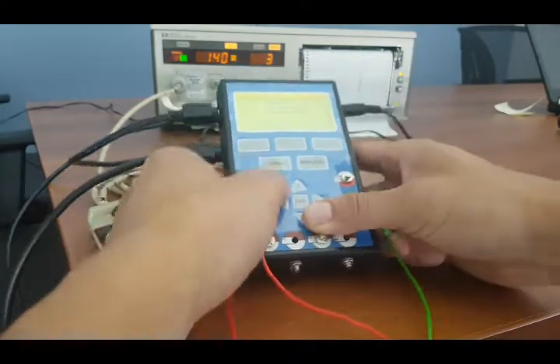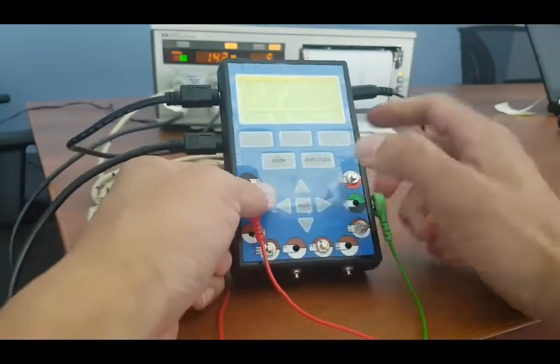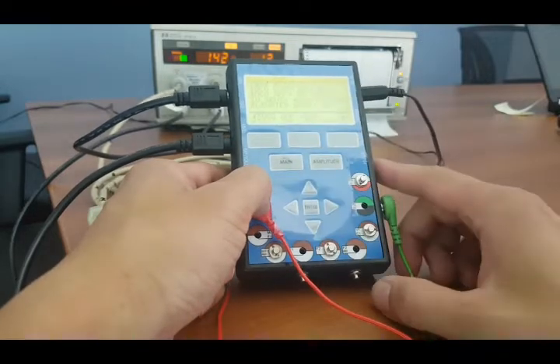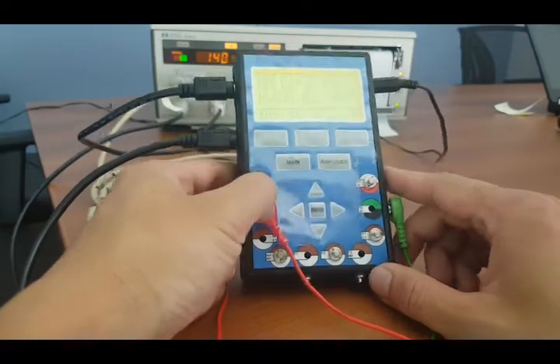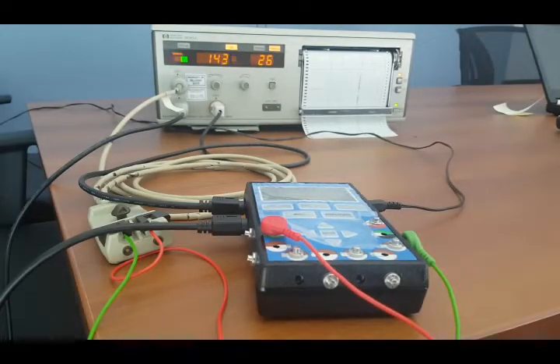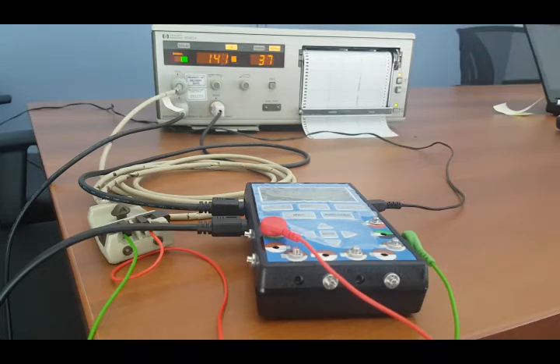So again, keep in mind while that's printing in the background, the maximum amplitude we want to reach is 50 units over 40 seconds. So the Toco external value will get, I think, about to 48 on this particular monitor.